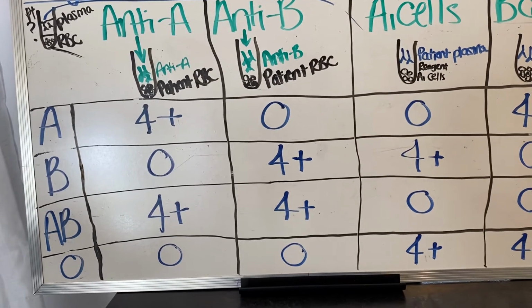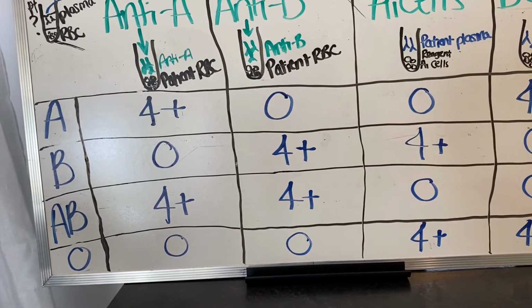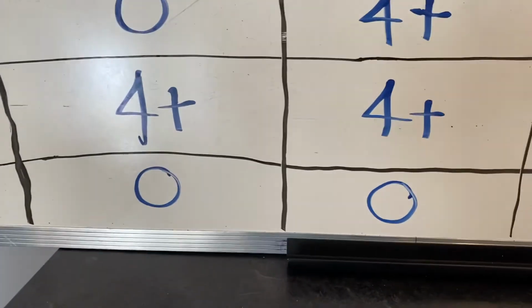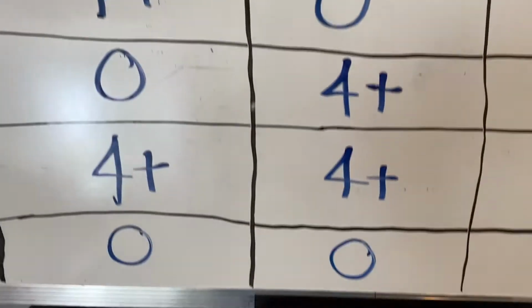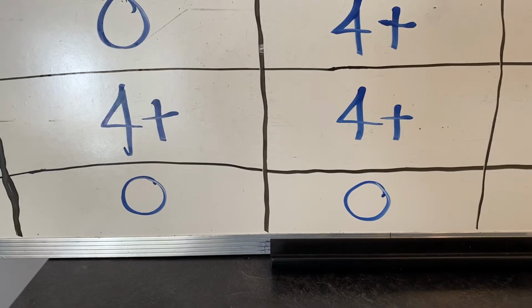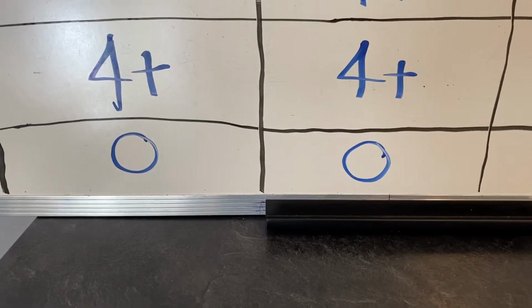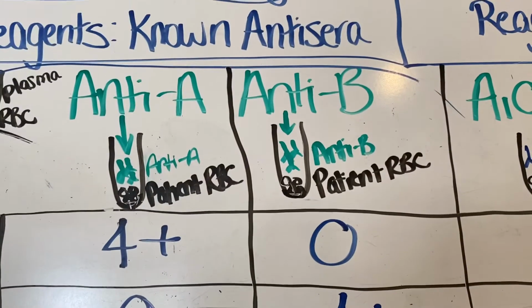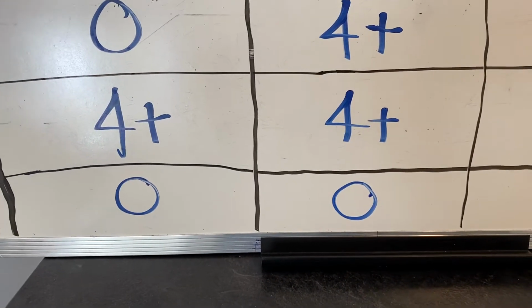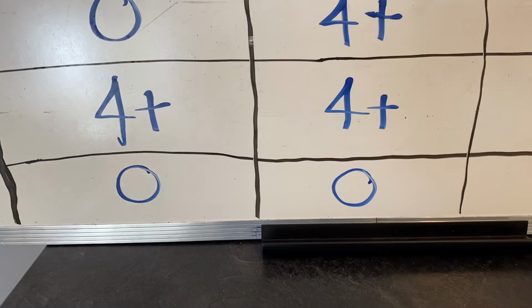That's what we would see on the red cell surface by the process of elimination of not having anti-A or anti-B. So I know we don't actually see the group O, but the way we do see it is by a lack of reaction here in the anti-A and anti-B. The group O phenotype presents like this. So the phenotype for a Bombay individual is also going to present like this, with a negative reaction in the anti-A and anti-B. So the phenotype of a Bombay is going to look like group O, but technically, genetically, they don't have the A or the B or the H antigens on their red cell surface.